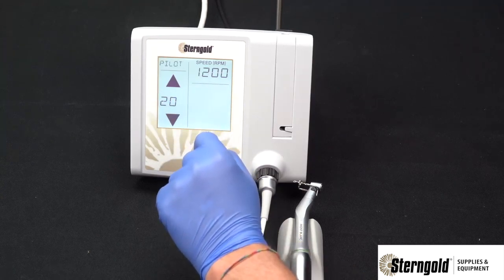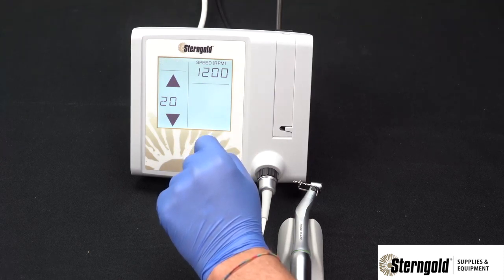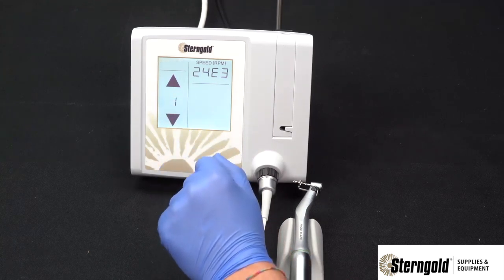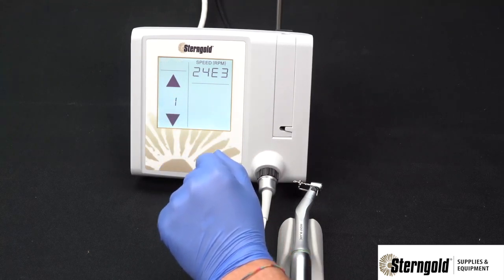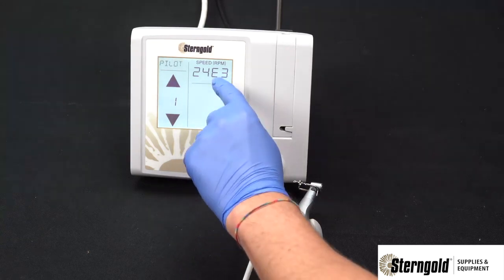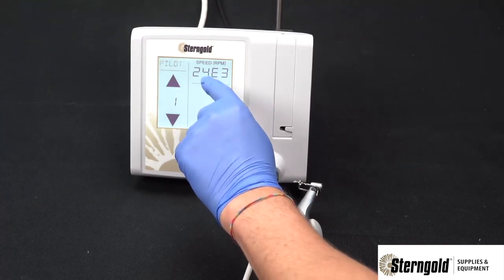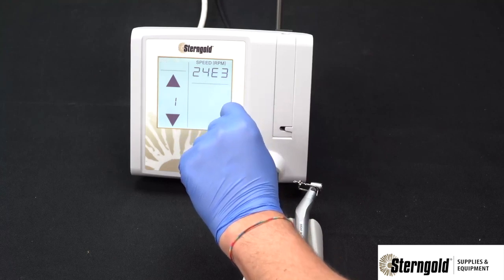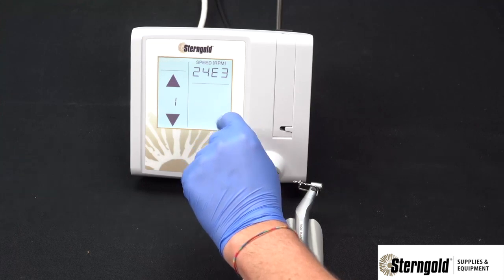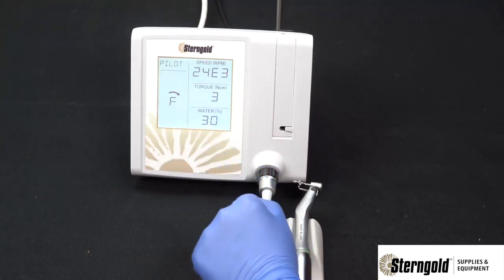At 20-to-1, the selectable speed is 15 RPM up to 2,000 RPM. At 1-to-1, the selectable speed is between 1,000 RPM and 40,000 RPM, displayed in scientific notation where E3 equals 1,000. So in this example, the motor and the burr will be rotating at 24,000 RPM. To return to the operating screen, independent of the selected handpiece, just press the speed section again.